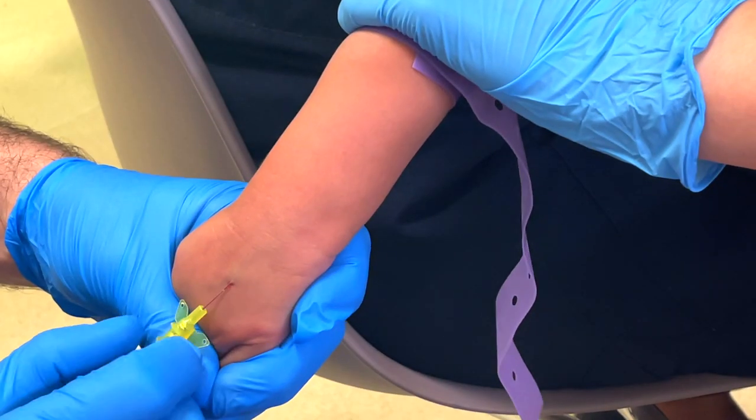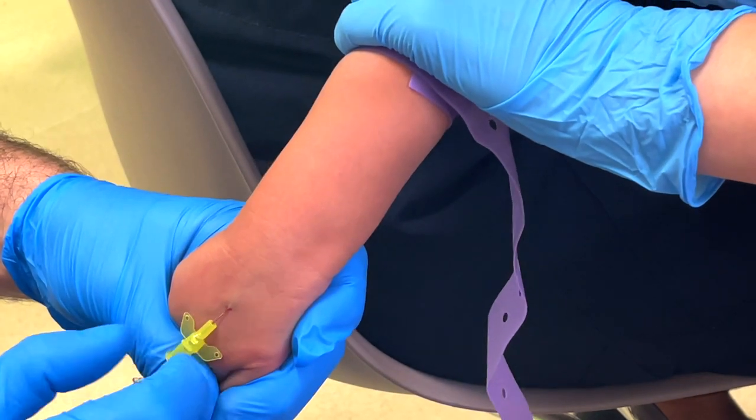Ideally you want a nice juicy, bouncy vein that looks straight, is easy to see, and is in a good location not near any bends. But life doesn't always work out that way, so we have to choose the best option available. Make sure you have a good look around at all the options so that you're choosing the best one.